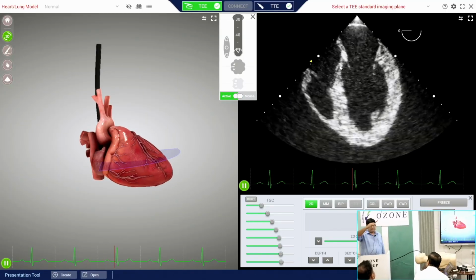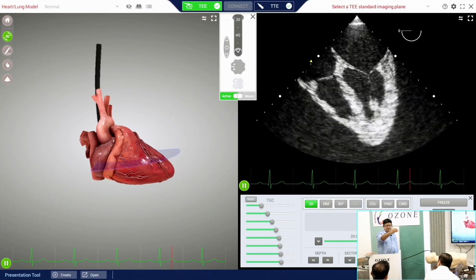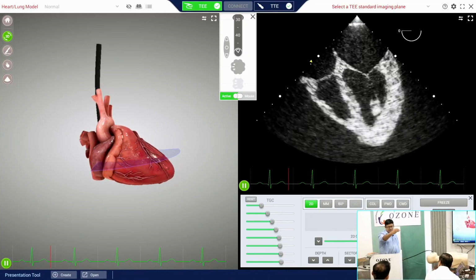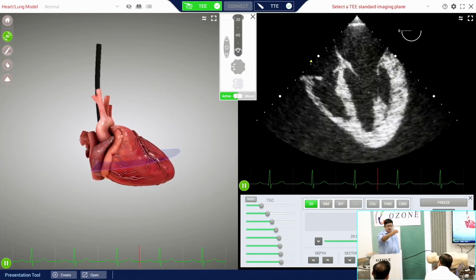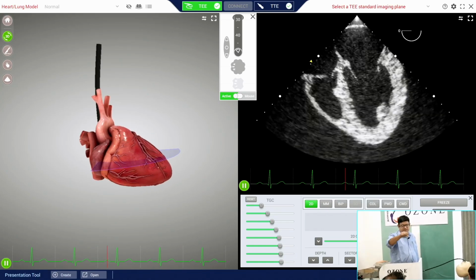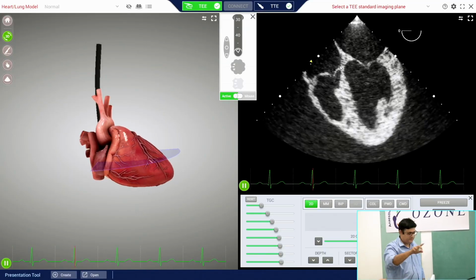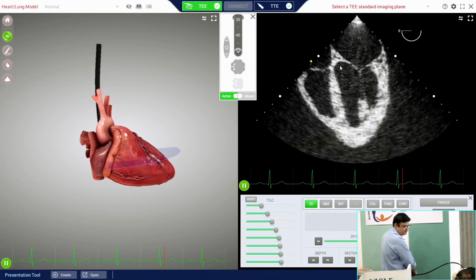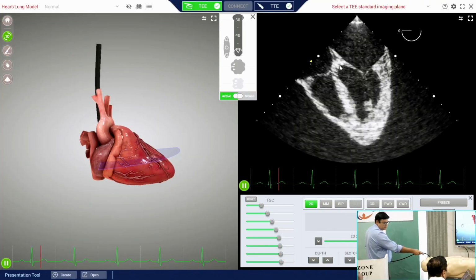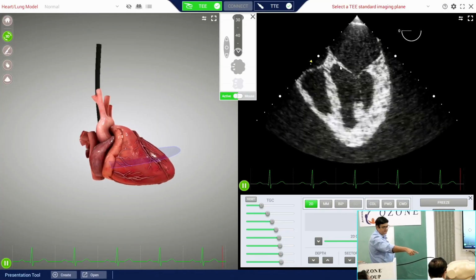So in your 4-chamber view, if the septal leaflet of the tricuspid valve is a little bit lower or apical compared to the mitral, then you are through the A2 and P2, and when you see all 4 segments at the same level, then you are at A3 and P3. Okay. So with this, always bring the mitral valve in the center, as I said.